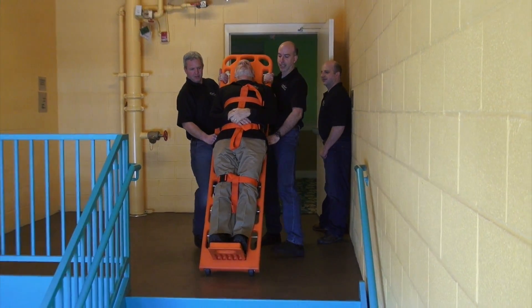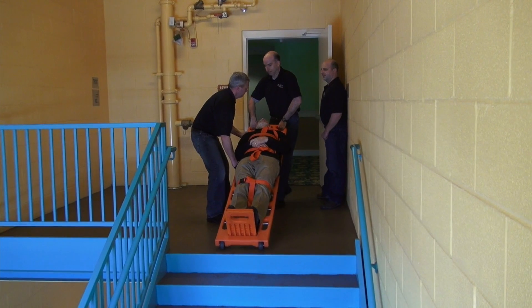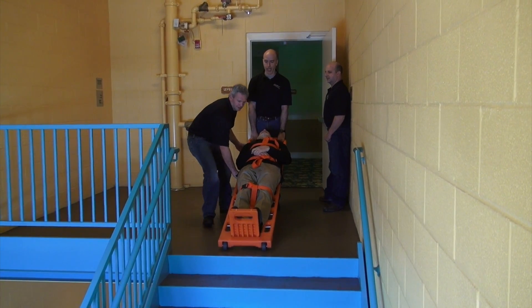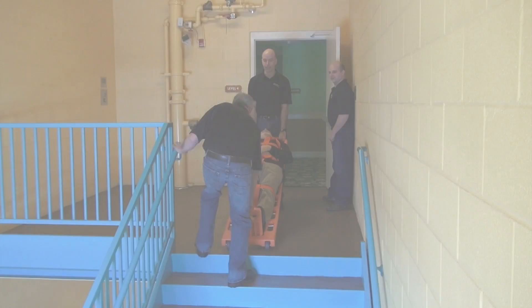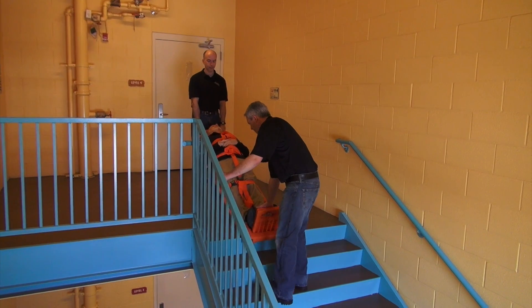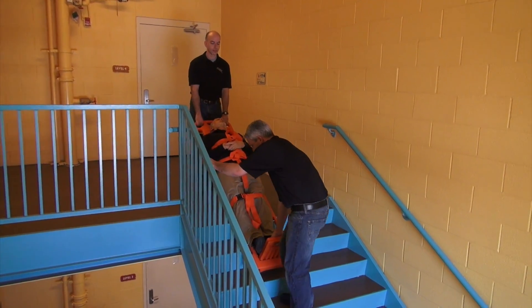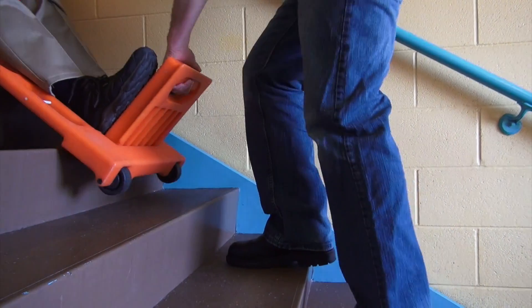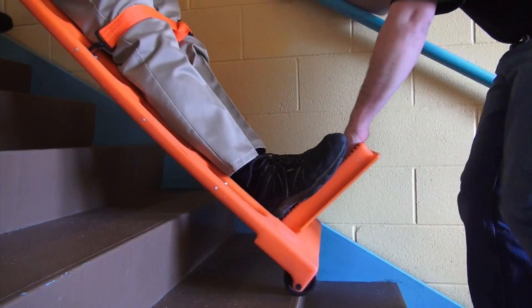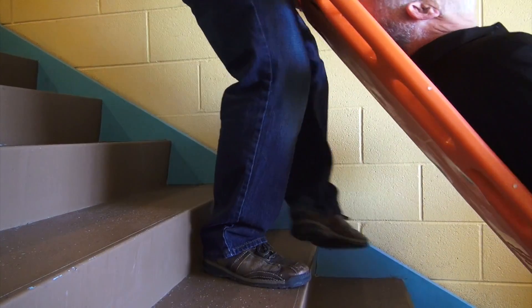He uses a hand-over-hand approach to move from the side of the board to the top of the board. When he has a firm two-hand grip at the top of the board, the second paramedic may let go. There is no need to lift the walkboard over individual steps. Paramedics simply guide the rate of gravity-powered descent and steer the path of the walkboard. The paramedic at the head controls the rate of descent, while the paramedic at the foot guides the path.